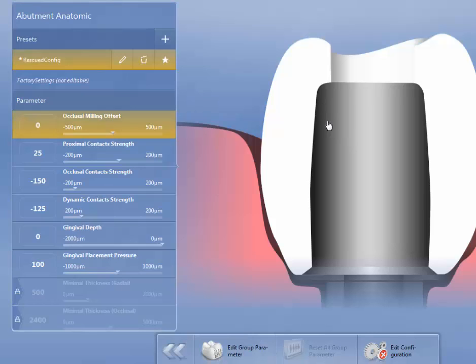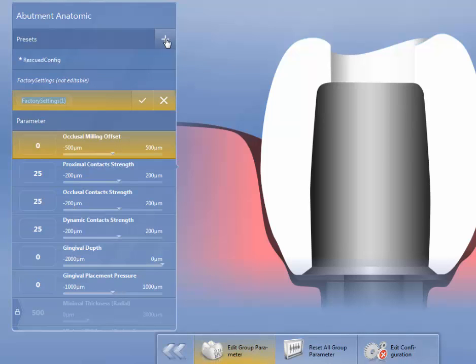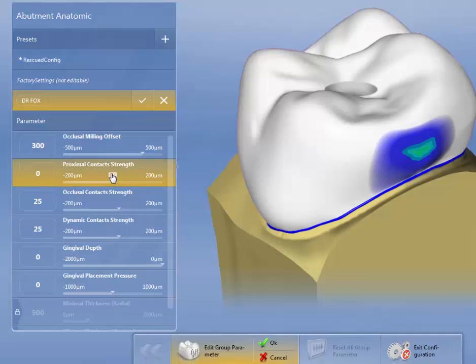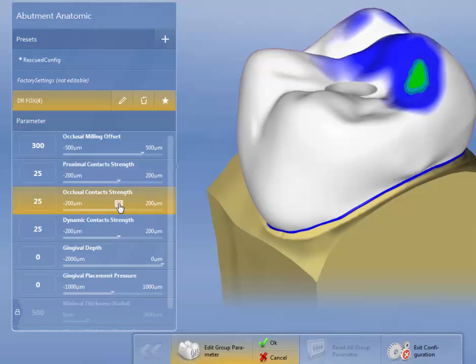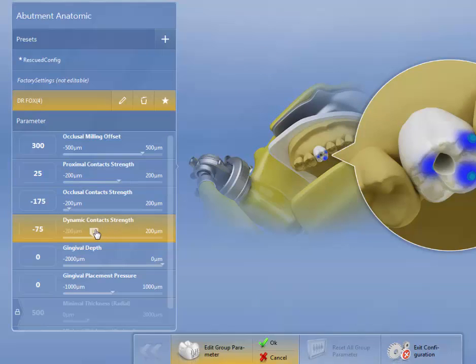Abutment, anatomic. This is a little bit farther than what we really need to go because you're only doing posteriors. But right now we'll just talk a little bit about this. Occlusal milling offset, again, I'm going to add my parameters that I use for this. Occlusal milling offset is zero. Proximal contact strength, because this is an abutment, there really isn't any. If you do a screw retained abutment like this one, then we'll set it to 25. Occlusal contact strength, we're going to set this to the minus 150. And actually I'm going to go to minus 175, because I like my implants to be just a little bit lighter out of occlusion. Dynamic contact strength, I still set this one to minus 100.